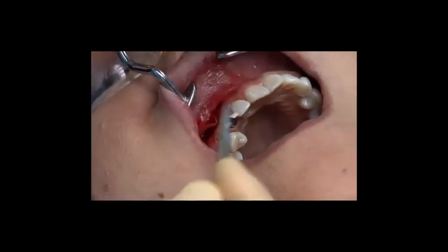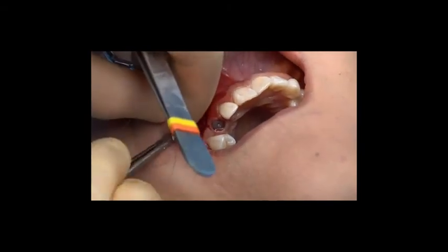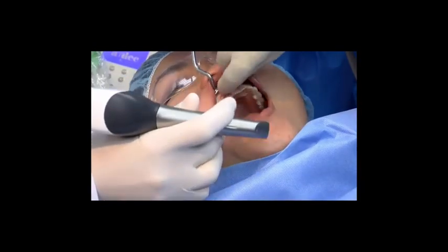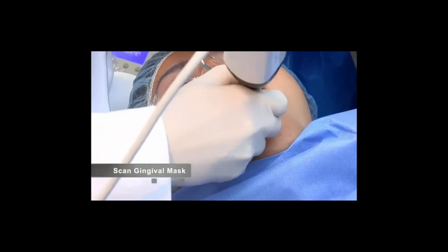So the first 3 sutures are tacked here in the middle and on the corners with a 6-0 polypropylene suture, and these are done, and then the rest is done with a resorbable plain gut or chromic gut suture.